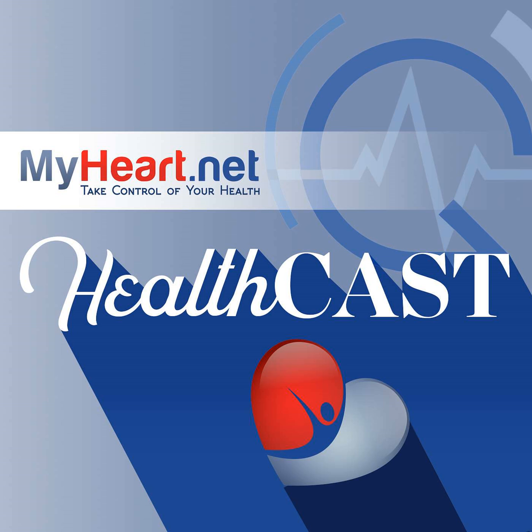Not 100%. It all depends on who is on call in cardiology. The younger people believe in CT, so we get more CTAs from them. But the older generation, unfortunately, still believe what they have been taught, what they grew up with. But yes, as you said correctly, the NICE, the England protocol, is now CCTA first in patients with suspected coronary artery disease. It actually started with coronary artery calcification in 2010, but in 2016, it turned over to CCTA as the first modality. I think here also it's probably going to change.